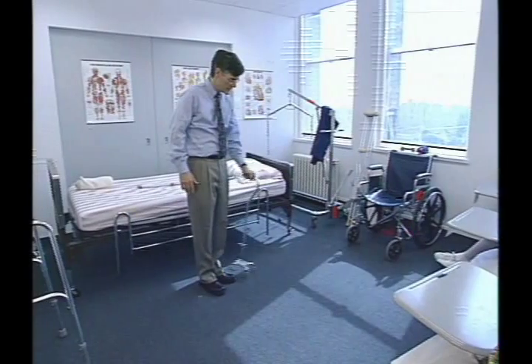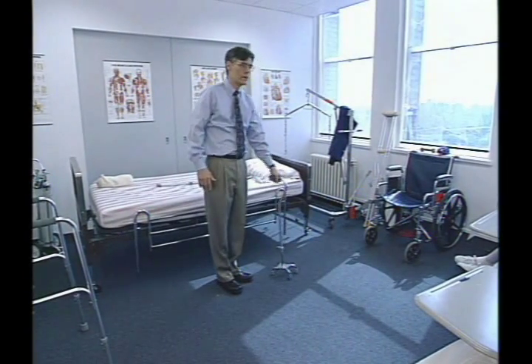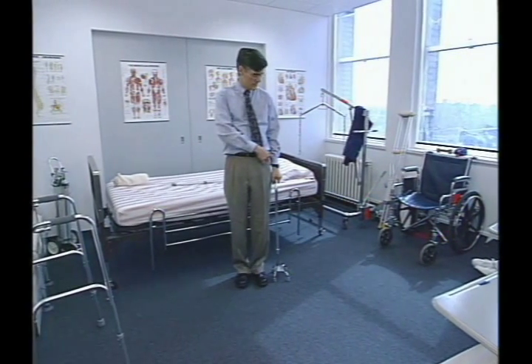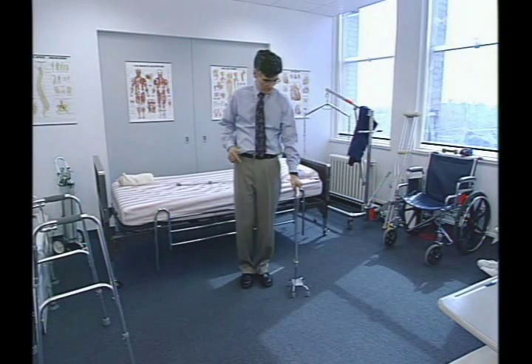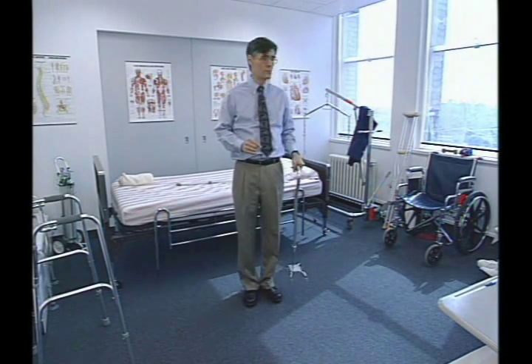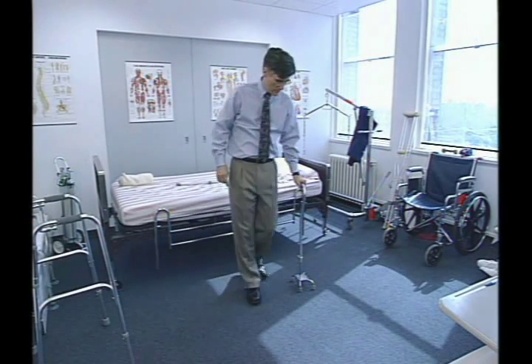You don't want to have a swinging motion with this cane — you just want it to be placed down. Tell the patient to keep the wrist near your hip. Obviously this cane is too short for me; it should be adjusted up to about here. But that's the idea: cane, right, left.